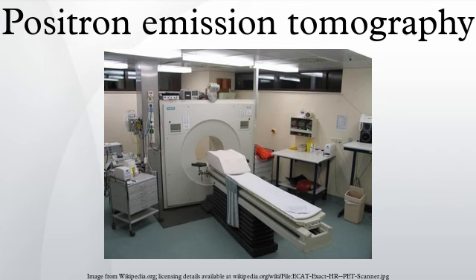A few other isotopes and radiotracers are slowly being introduced into oncology for specific purposes. For example, 11C metomidate has been used to detect tumors of adrenocortical origin. Also, FDOPA PET-CT, in centers which offer it, has proven to be a more sensitive alternative to finding, and also localizing, pheochromocytoma than the MIBG scan.